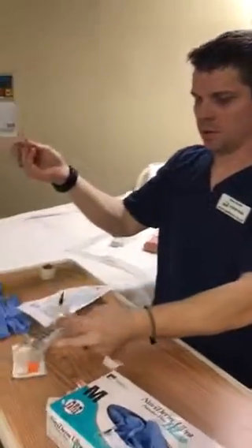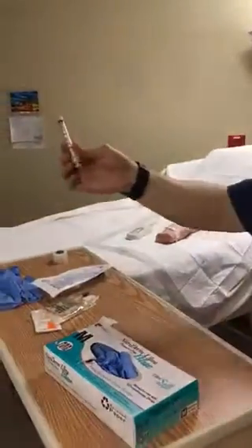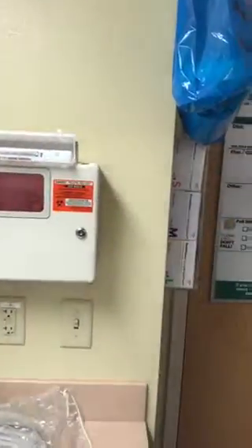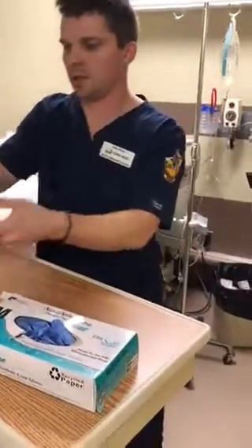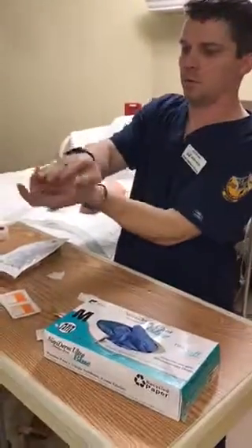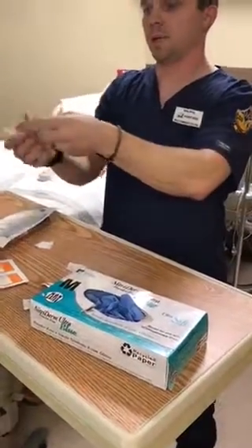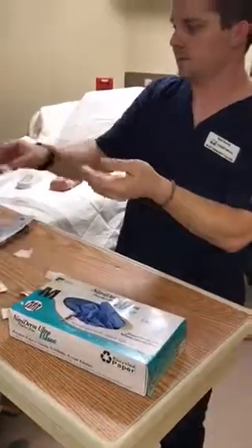And I'm going to go ahead and lay that on a clean site, and I'm going to walk this over to the sharps container. Then I'm going to dispose of this needle right there. And I'm going to go ahead and mix that by turning it, not shaking it.